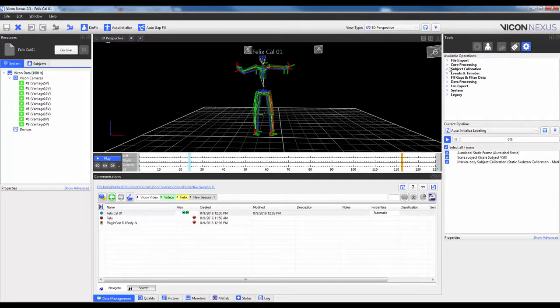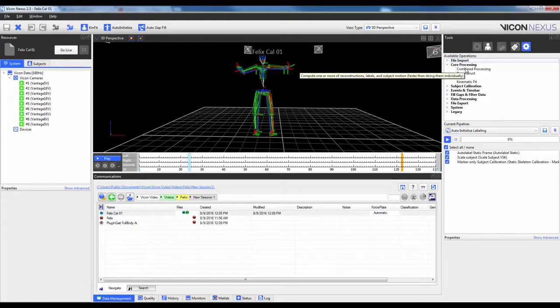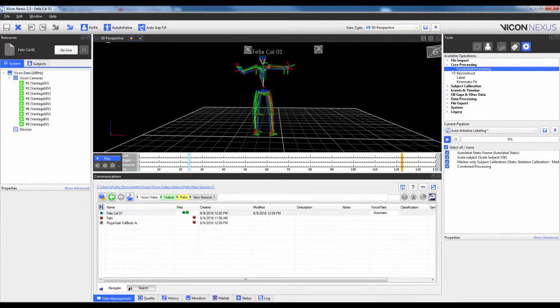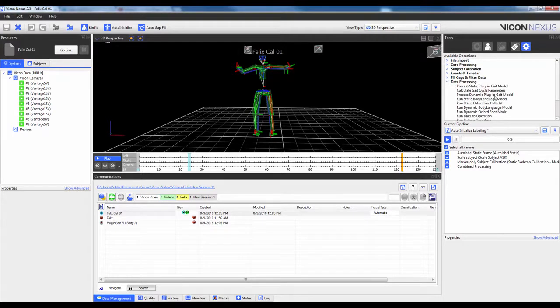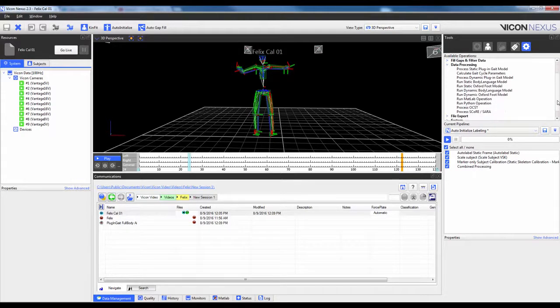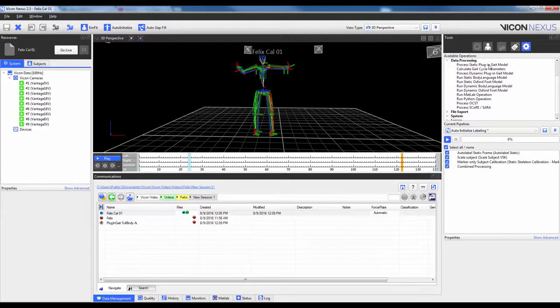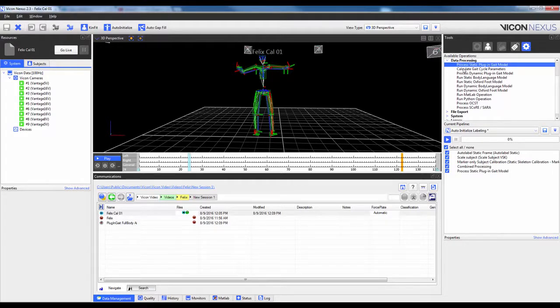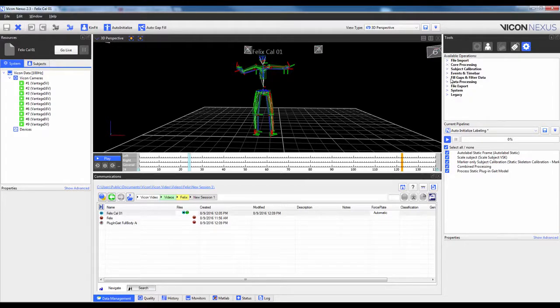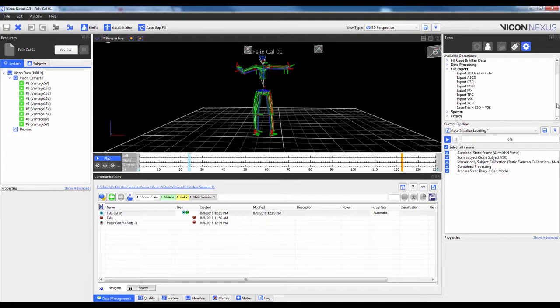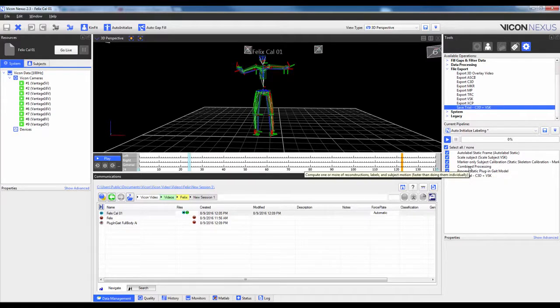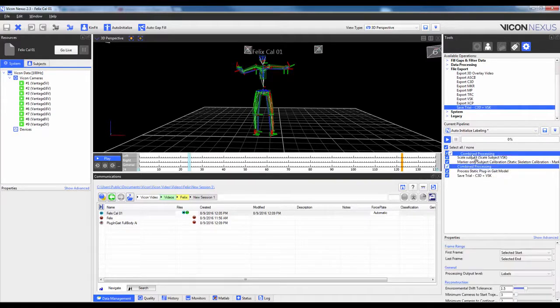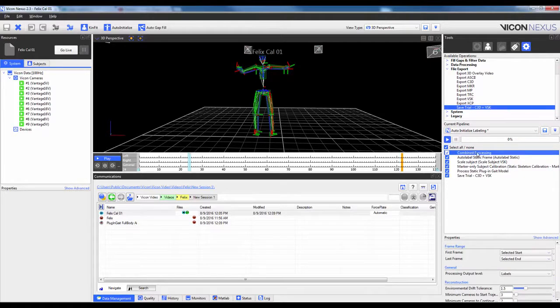So we'll first start off with the Auto-Initialize labeling pipeline. Then, under Core Processing, I'm going to go ahead and add in Combined Processing. Under Data Processing, I'm going to add in the Process Static Plug-in-Gait Model. And then under Export, I'm going to add in Save Trial, C3D, and VSK. I'm then going to just reorder it so that Reconstruction will actually be first the Combined Processing.